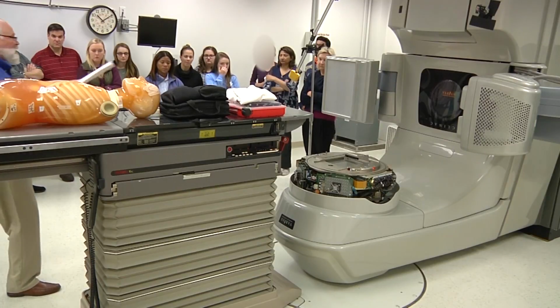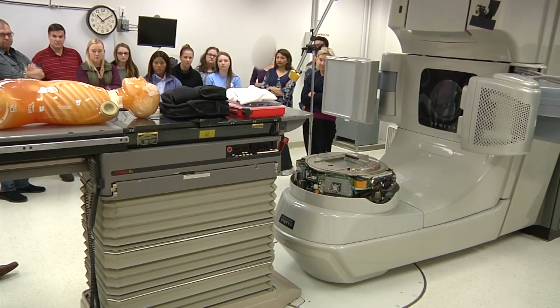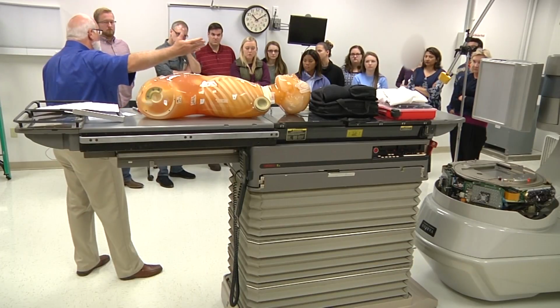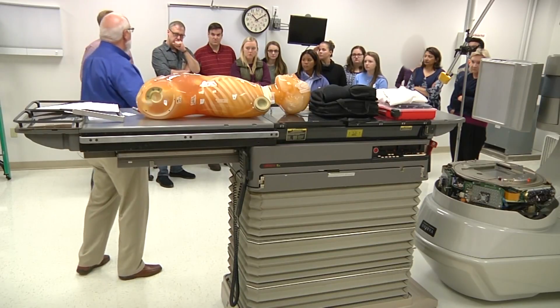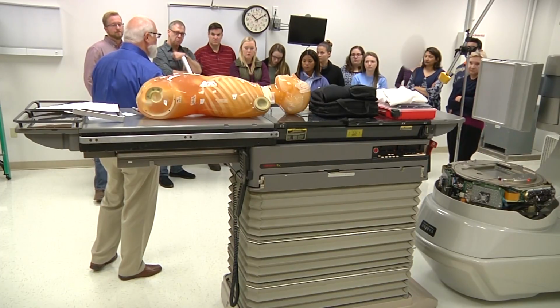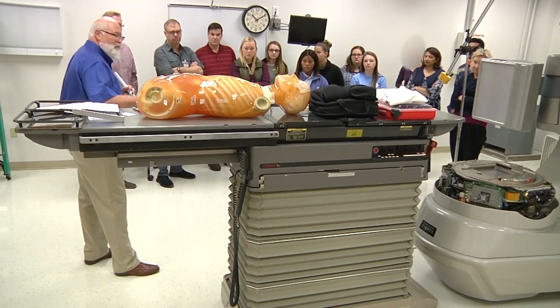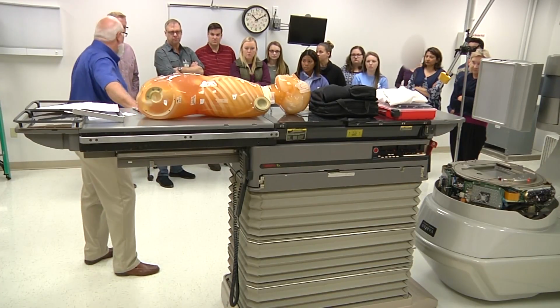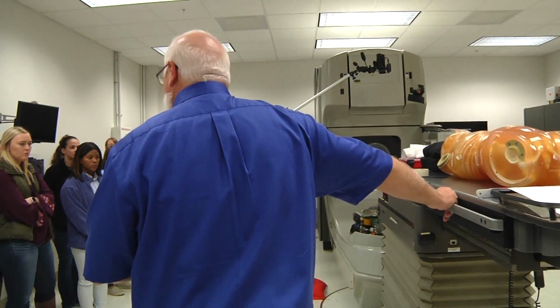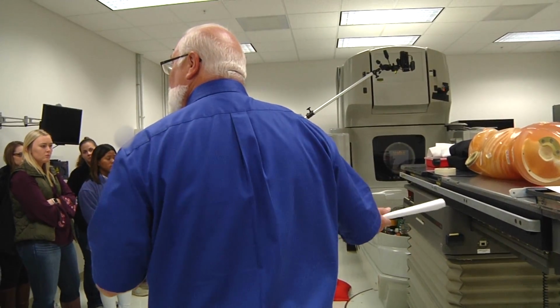If you use a lot of linen, you'll see a lot of dust buildup on these rails. Those are things where you want to tell your engineer if you see a lot of dust in your room on top of the modulator. All that dust also gets into the components. So you might have a maintenance problem in your facility. They need to change the air filters or something like that. If you have an excess amount of dust, it clogs up the bearings and your couch doesn't move very well. So you tell your engineer that, hey, maybe you need to come in more often to clean the couch.